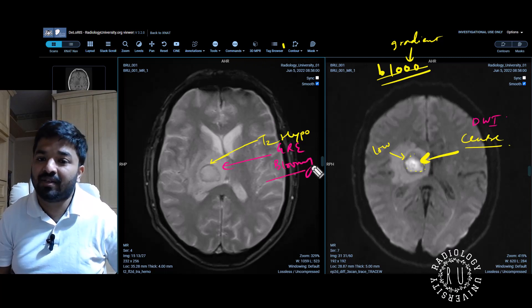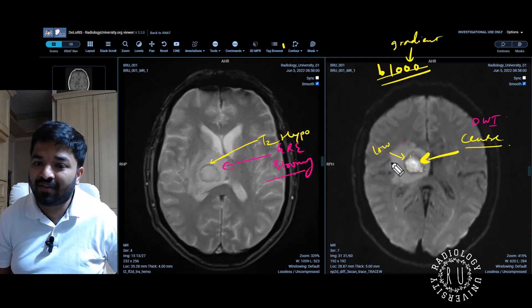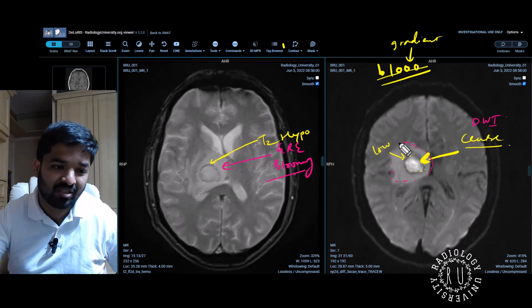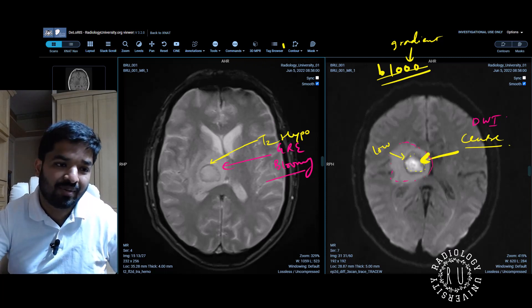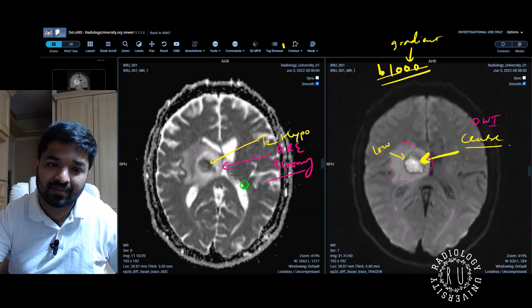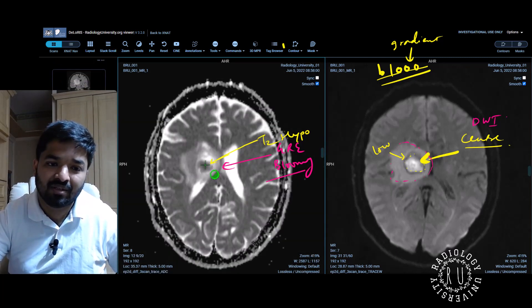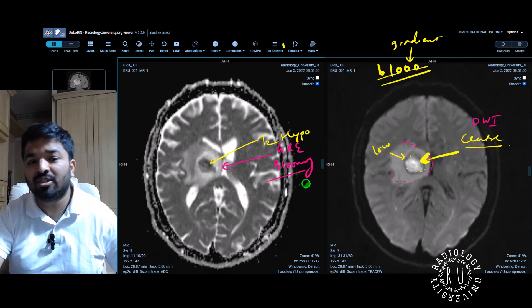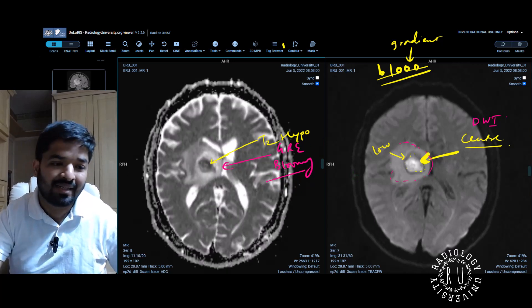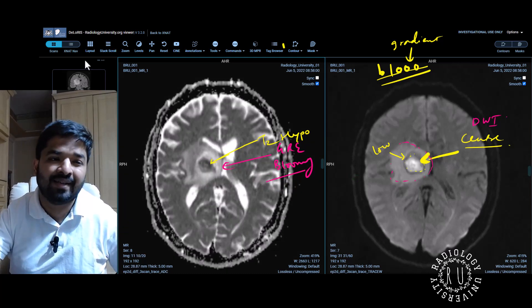So you have something which is T2 hypointense around the rim on DWI, there is central diffusion restriction, and on GRE there is blooming. You also have a peripheral area which is not really showing diffusion restriction, and you can confirm that on ADC — the surrounding area is not showing much diffusion restriction. So what is that? That is likely edema.